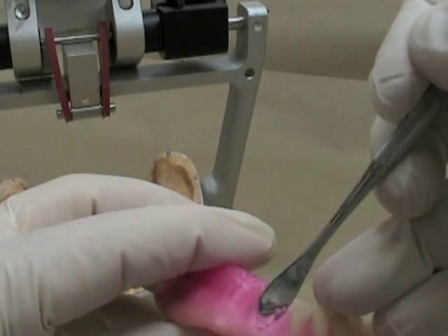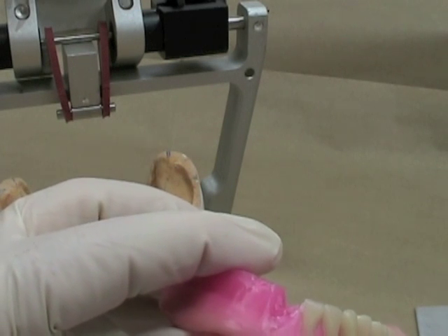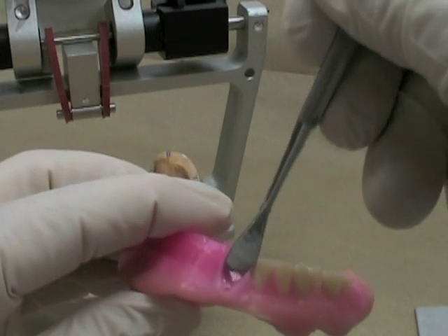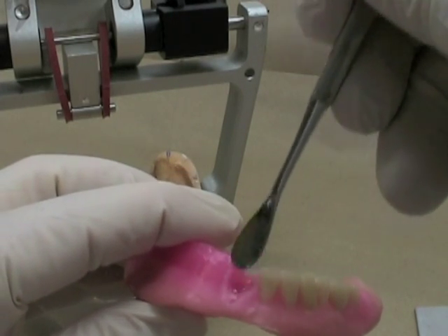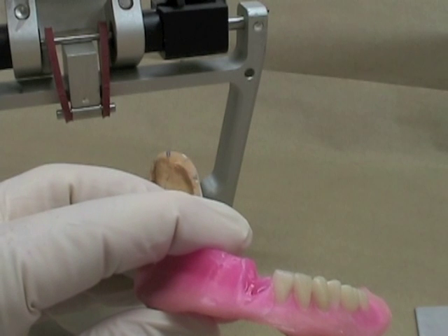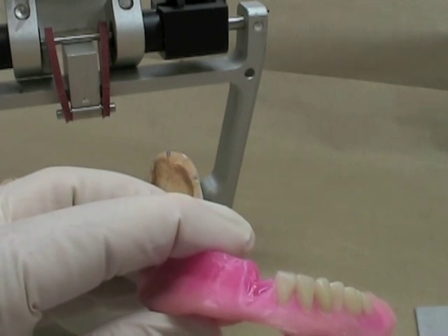Make sure that your wax is nice and molten. If you don't soften the wax all the way through you're going to get bubbles and air pockets. It's going to look like white dots in the wax, and it doesn't look particularly good when you're doing the wax try-in to show the patient what it's going to look like.